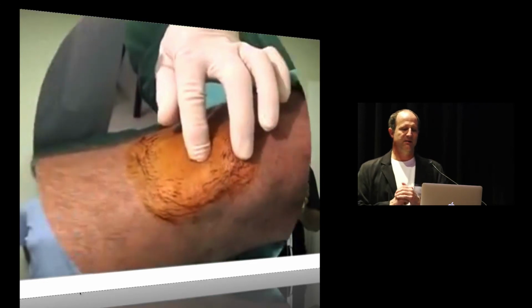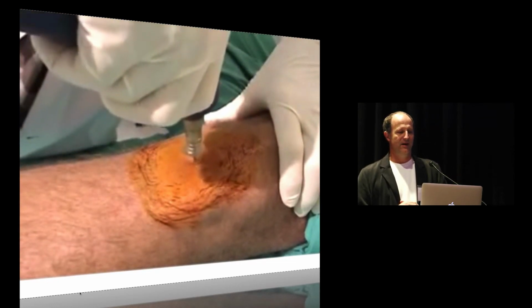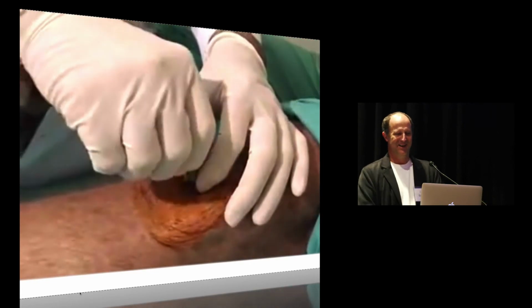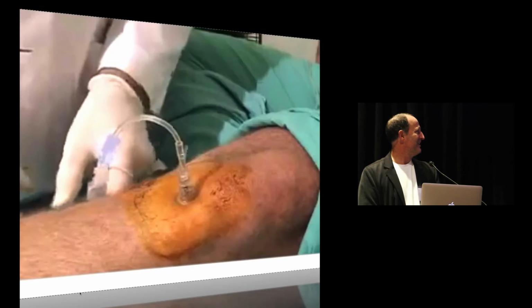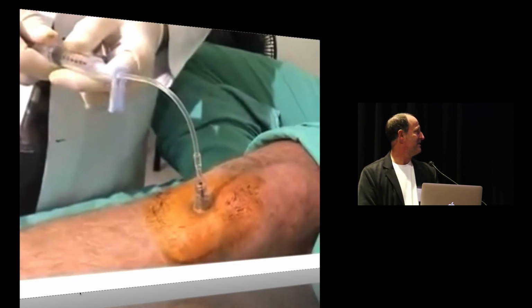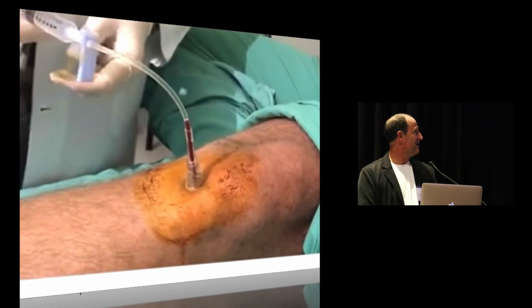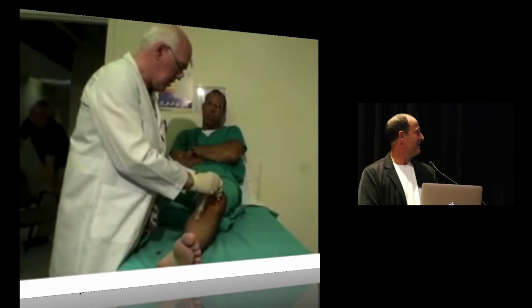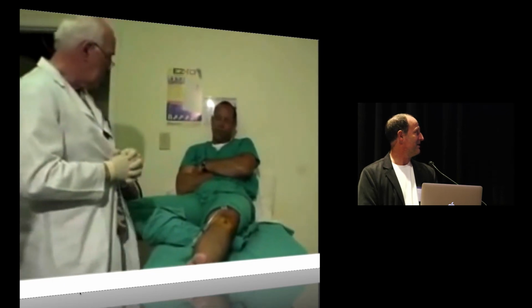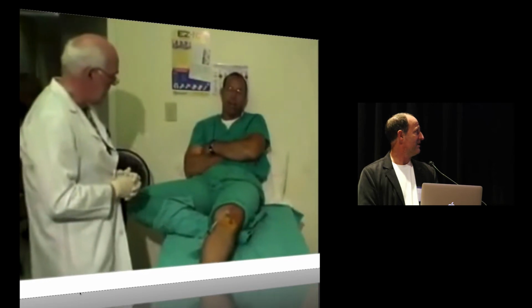And here they are putting in these intraosseous catheters. And a little gruesome looking, but yeah. What? Yeah, that's definitely a tube. All right, now we're going to aspirate. I can't feel you aspirating. Isn't that beautiful? Oh, it's coming out so easy, the blood is. And I can tell you that the insertion was like next to nothing. Really? Absolutely next to nothing. Wow. It was fast. It was doing it It really, really easy. fast. It was shockingly easy. I've had IVs that hurt worse.